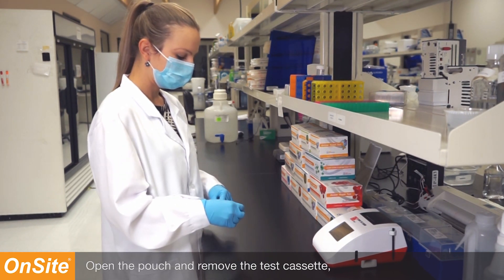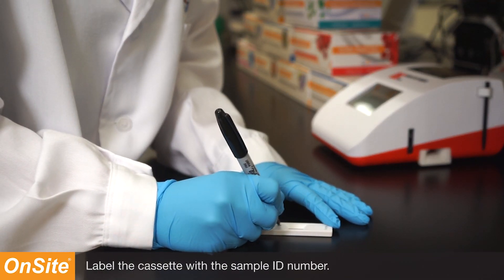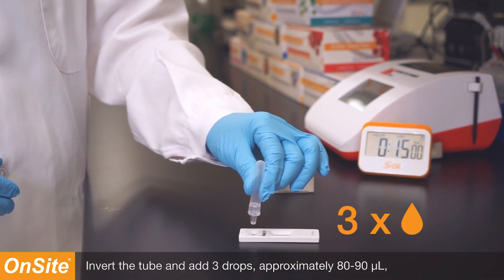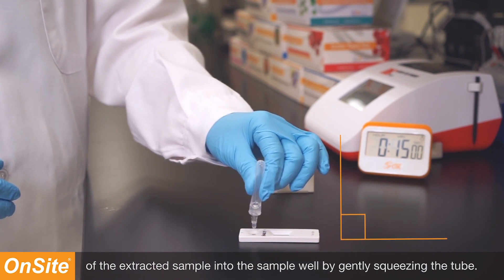Open the pouch and remove the test cassette, placing it on a clean, flat surface. Label the cassette with the sample ID number. Invert the tube and add three drops, approximately 80 to 90 microliters, of the extracted sample into the sample well by gently squeezing the tube.